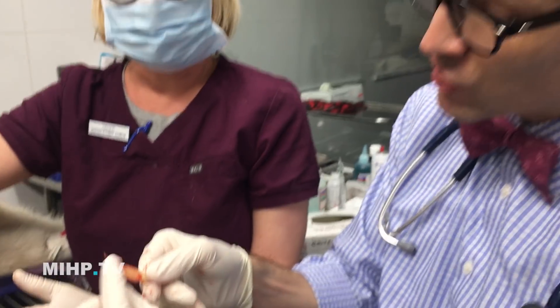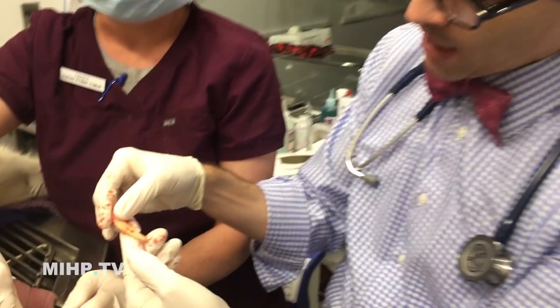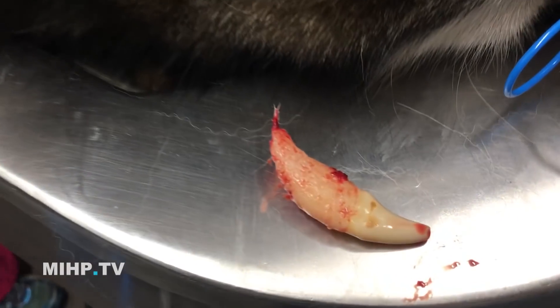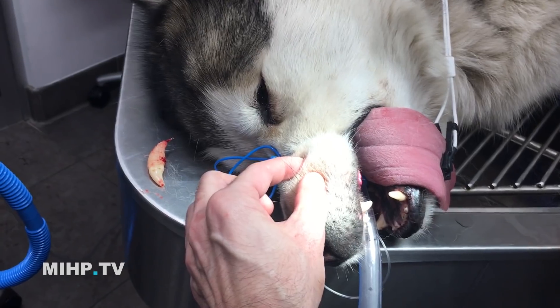The interesting thing here is how much of the tooth is underneath and how much is below. It's like an iceberg, right? Yeah, it's massive. And we could just try to get an x-ray of this area and make sure there's no loss of bone or anything.